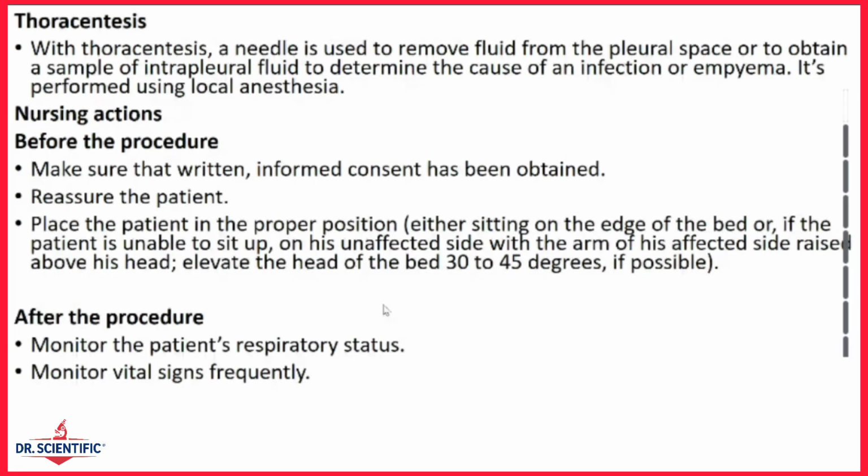Otherwise, you are going to infect the patient. After the procedure, position the patient on the unaffected side for at least 1 hour. Then monitor the respiratory status of the patient, and monitor the vital signs frequently, about every 15 to 30 minutes for the first 1 hour, and then you can space that out progressively.